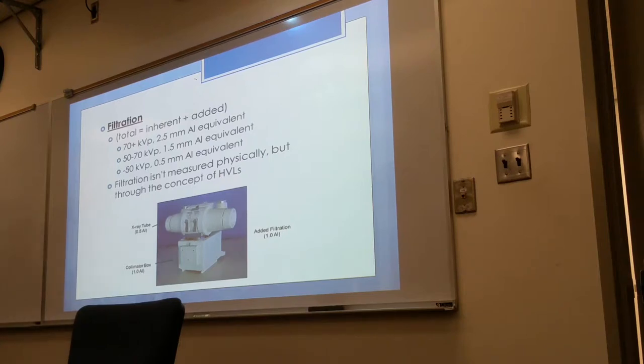Okay, what is the purpose of filtration? Filter out the weak rays. Okay, remember the x-ray beam is heterogeneous, polyenergetic, right? It has many energies. So the beam is composed of low energy X-rays and high energy X-rays. So the purpose of the filter is to remove the low energy X-rays to make the beam harder, more uniform.